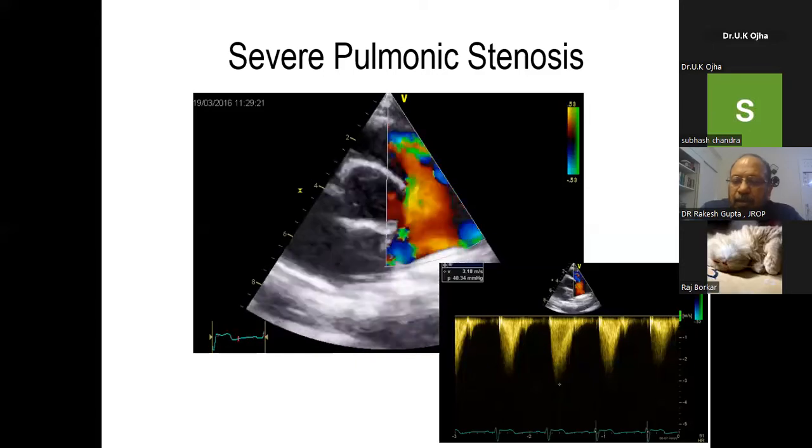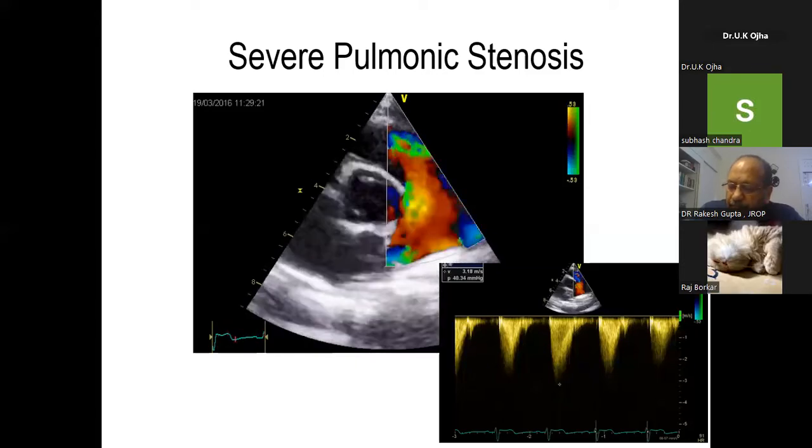Sir, hello, sir. Yeah, go ahead, Raj. Sir, is there a role of M mode for the pulmonary valve?